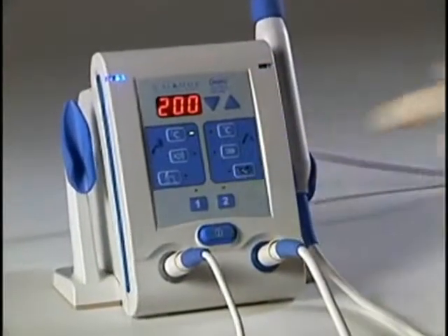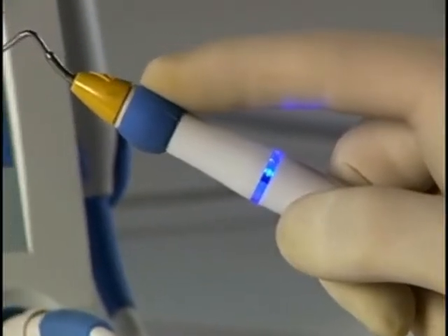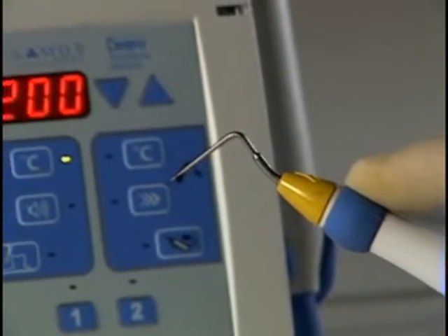With the unit on, press the 360 degree activation cuff on the handpiece to begin heating the electric heat plugger to the selected temperature setting.